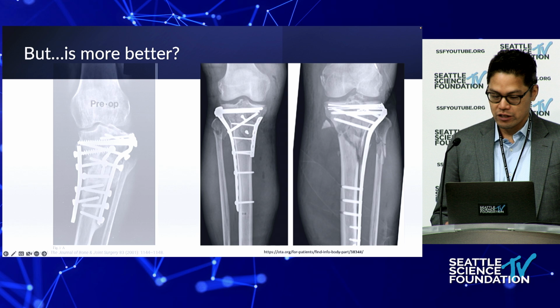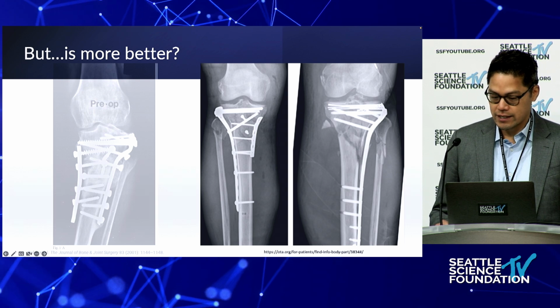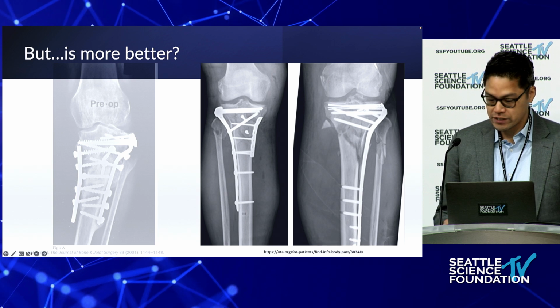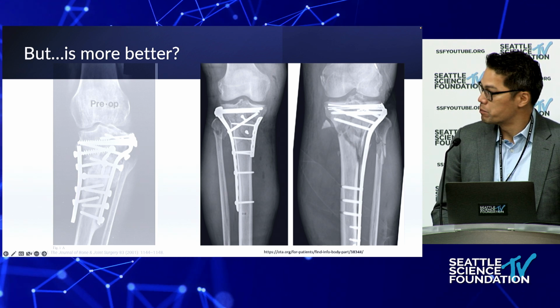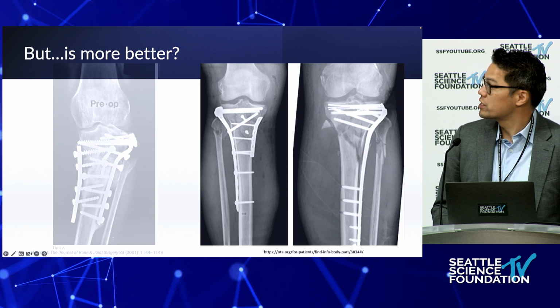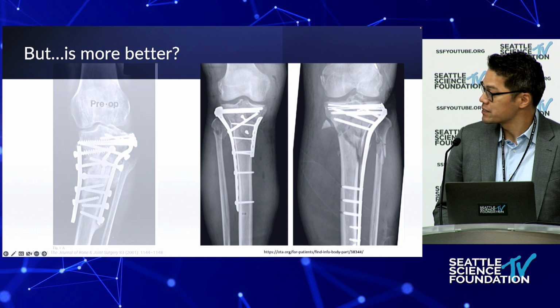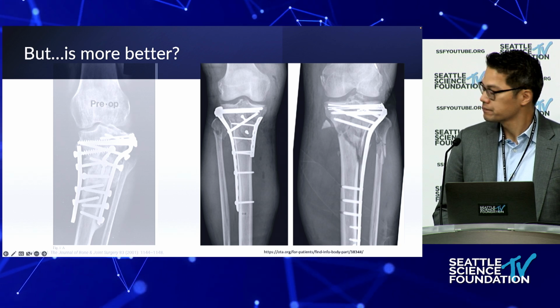The fracture fixation principle is load sharing, and we want to distribute the forces across and along the bone to prevent stress risers and stress shielding. Notice here the use of long plates to distribute the force along the diaphysis and spread out the forces.